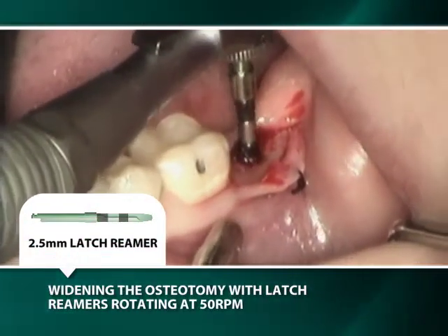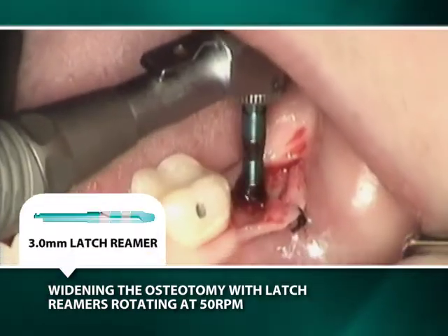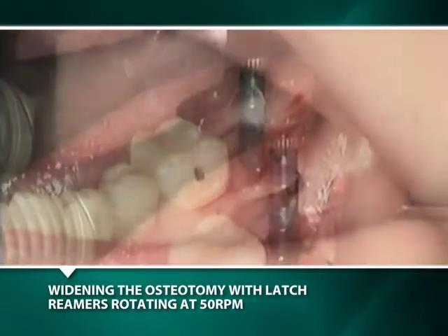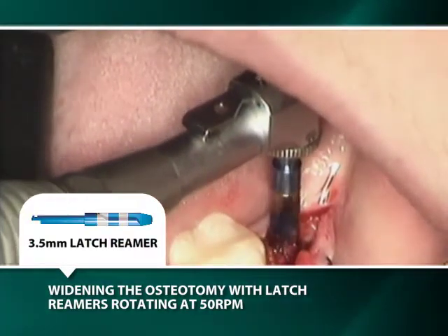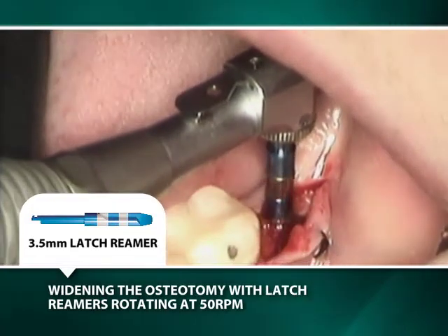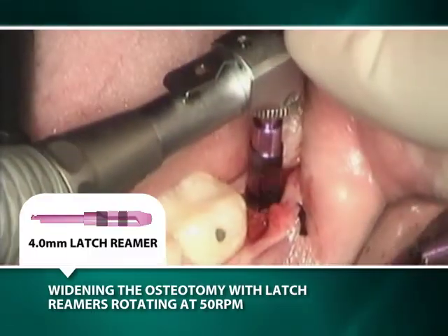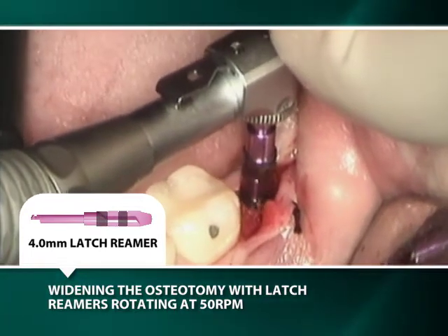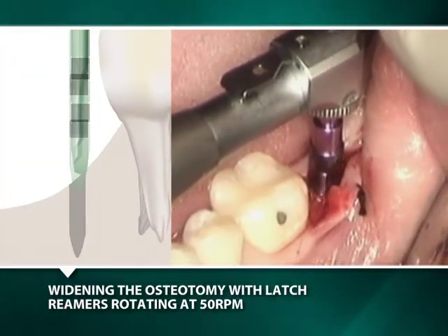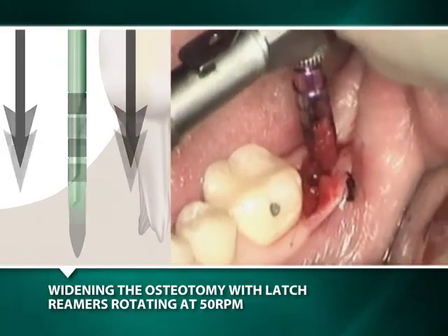The osteotomy is prepared sequentially with half-millimeter wider latch reamers rotating at 50 RPMs without irrigation, which means a quarter of a millimeter of bone shaving is removed from the radius of the osteotomy with the use of each reamer. The latch reamers should be rotating prior to their being slowly inserted into the osteotomy. The parallel walls of the osteotomy will guide the latch reamers into position. Care must be taken to avoid displacement of the latch reamers by either a discrepancy in the height of the bone at the orifice of the osteotomy or by denser bone at one portion of the osteotomy. Once the parallel walls of the reamer are fully engaged, the clinician's grip may be relaxed and the surgical preparation may proceed more quickly as increased apical pressure is applied.